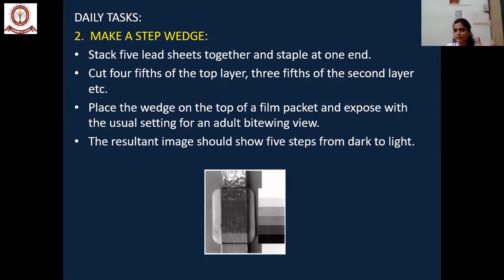So after creating this lead wedge, keep it on the film and expose it, and get the film processed. The film will show the 5 steps of lead wedges with a different density from the top layer to the bottom layer, because we are keeping one layer one by one as a step.